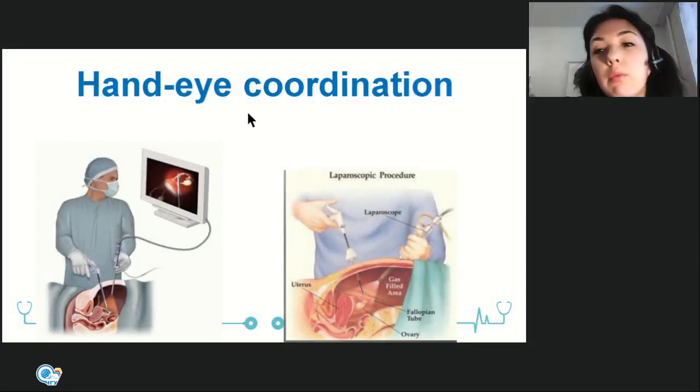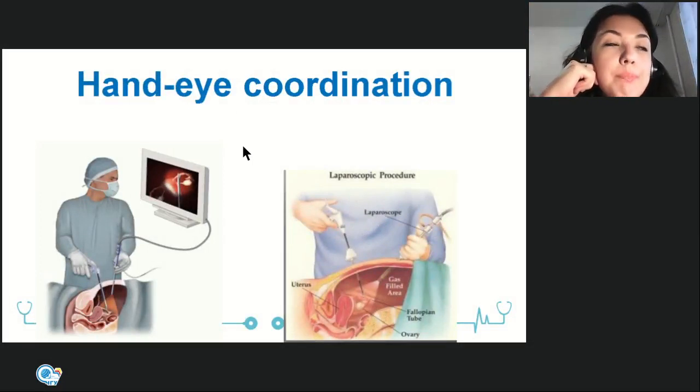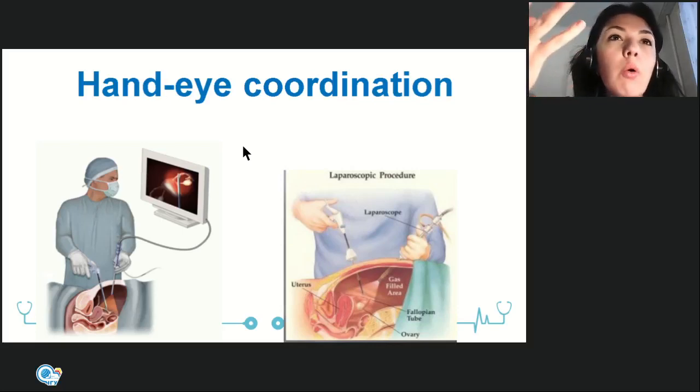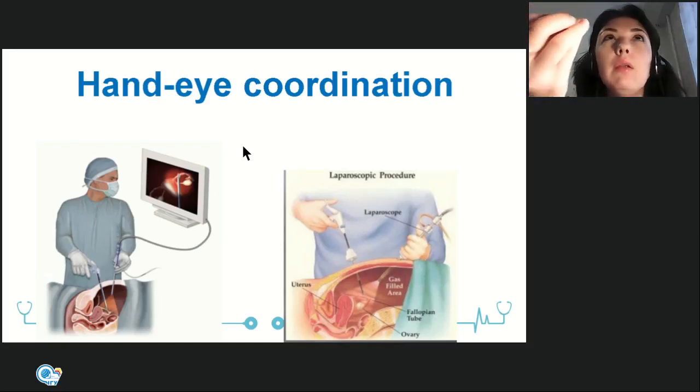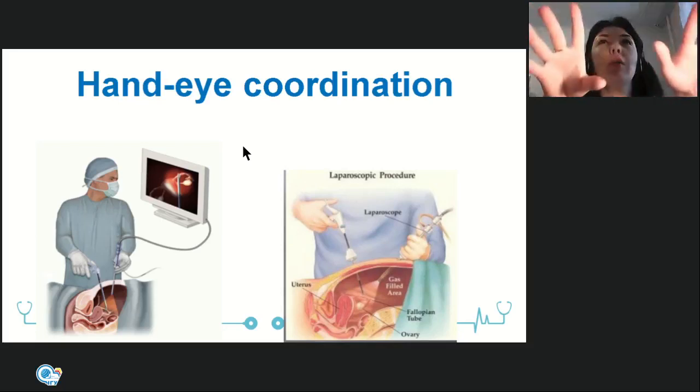Okay. Yes, what is it like for the surgeon? For the surgeon, it's not quite easy to master this minimally invasive surgery, because we are used to looking with our eyes at the object of our labor, of our action. And here it is something different. We are working somewhere in the cavity and we are watching on the screen.